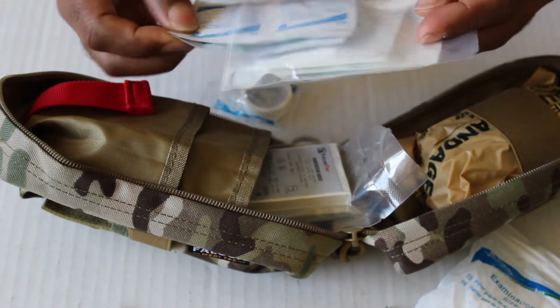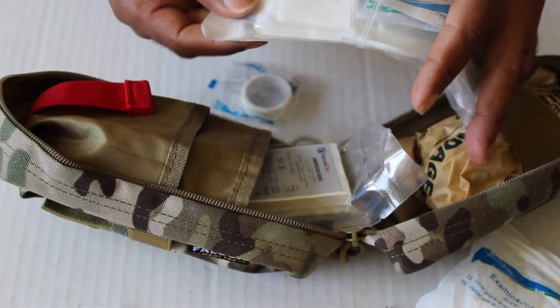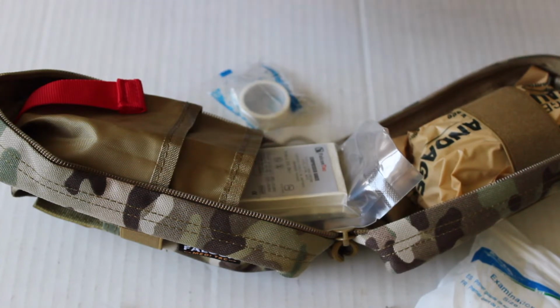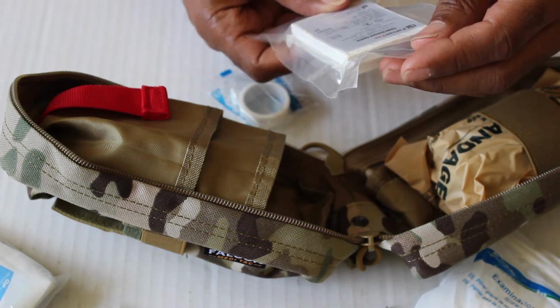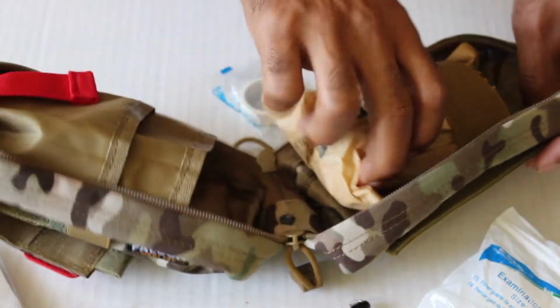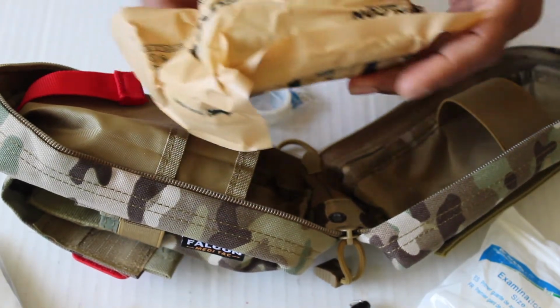Bandage tape, wipes, sanitary wipes, gauze, another bandage, adhesive wound dressing. Compressed gauze, and the last piece that's in the bag is an emergency trauma bandage, compression wound dressing.